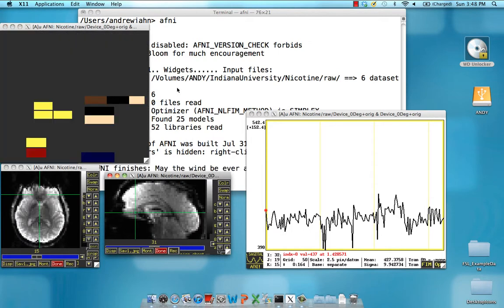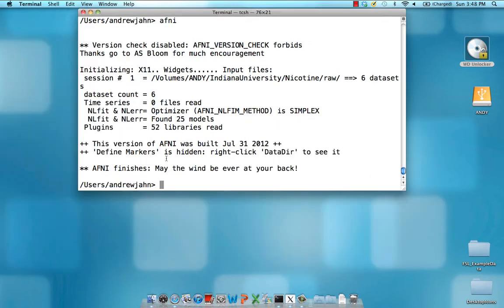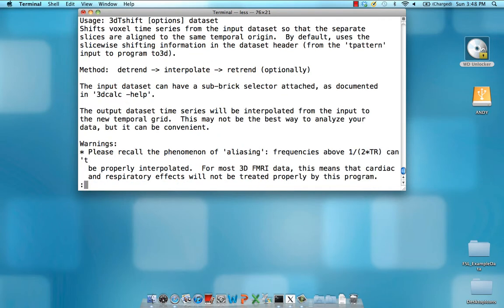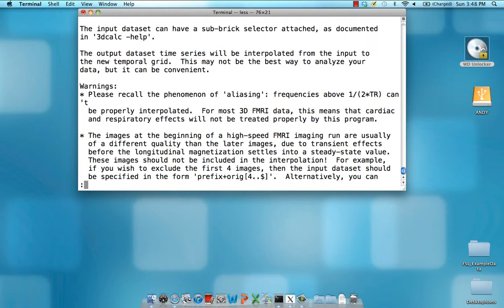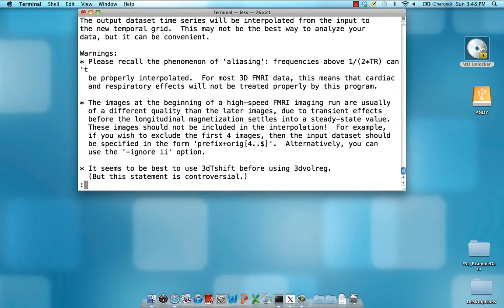Now to do this, we have a command called 3DTShift. Now you can get the help just by typing in 3DTShift and no other commands. It's also helpful to pipe it to the command less so that you can scroll through the help more easily.